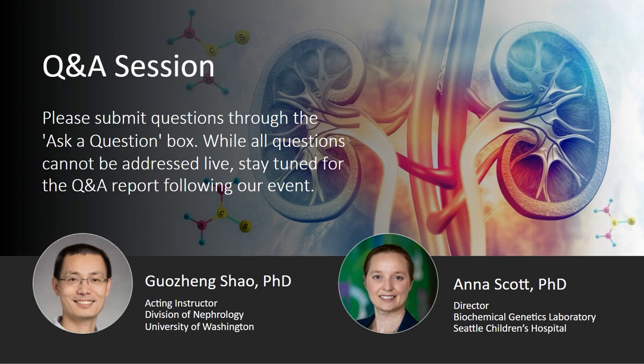And still another point is that to further enhance the efficiency in terms of urea removal, we have shown through the simulation that urea diffusion to the electrode is limiting its removal rate. And we want to optimize our flow pattern and increase the efficiency, the rate of urea removal, and shrink our device dimension and weight. Yeah, fantastic. Okay, that all makes sense to make it more portable.